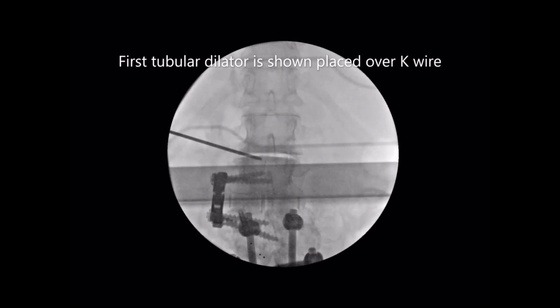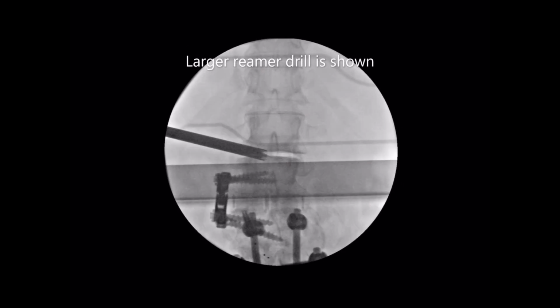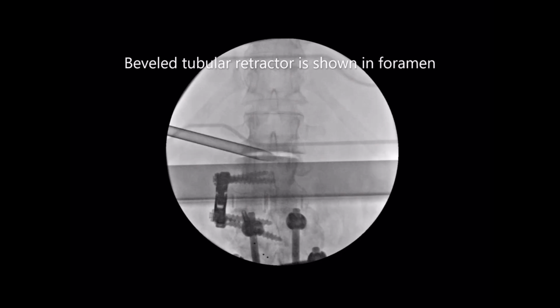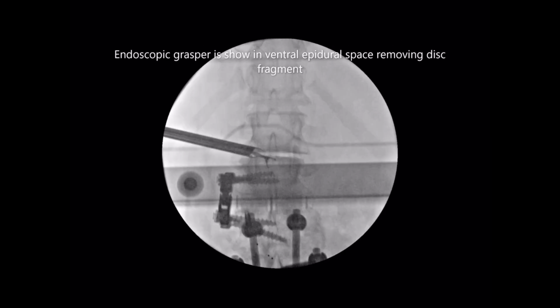We can now begin utilizing the dilators to access the level of L1-2 by stretching the muscles. We can insert the same reamer drill as the prior case to shave a small portion of bone. When the reamer drills have done their job, we can tap in the beveled tubular retractor, take an additional AP and lateral radiograph to confirm our location. Please take note that the retractor is in the foramen and not intradiscal.